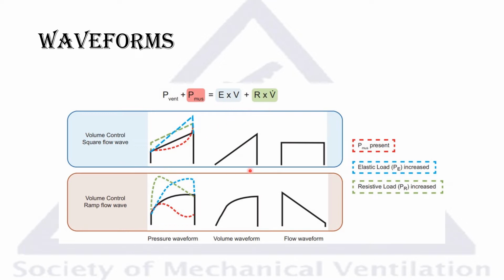So if you look, this is the constant flow, and this is how the airway pressure looks in the black line. It looks like a triangle, as we talked about. And this part in the beginning, as we talked about in the last slide, is the resistance. If the resistance is high, the shape changes a little bit. It increases in that green dotted line. If the compliance worsens, the airway pressure changes a little bit, and you add this blue line.